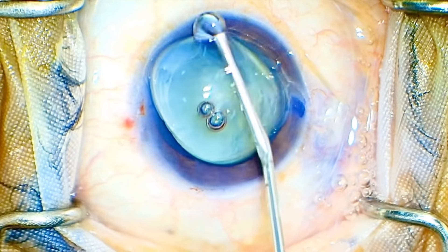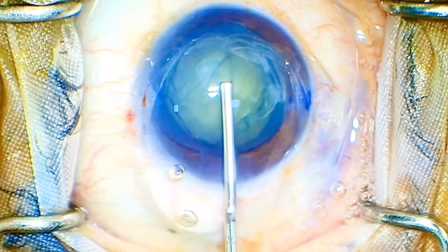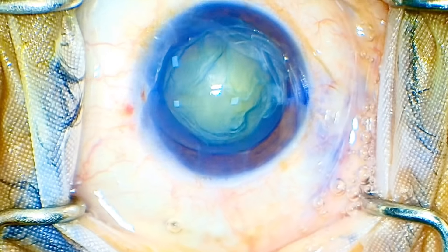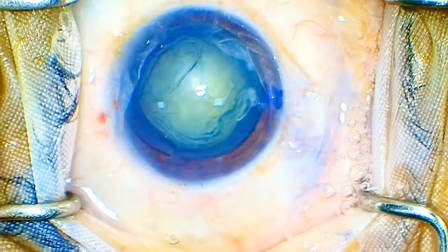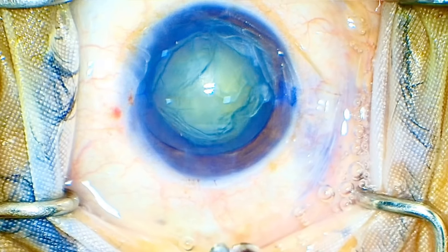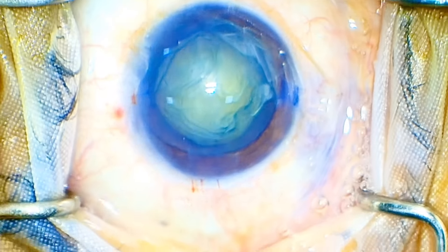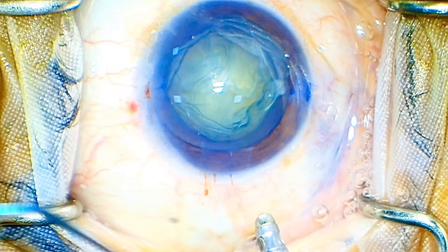I'll be starting the chop. I thought it's a beautiful, normal case and I'm going to give this lady 6/6 the next day — but things did not happen according to my predictions. Introducing the FACO, I am running an Oertli Swiss Tech that is around 8 or 9 years old. This machine has not failed me once and the pump works beautifully. My OT assistant handed me a blunt dialer, so I asked him to hand me a good chopper for those chops.